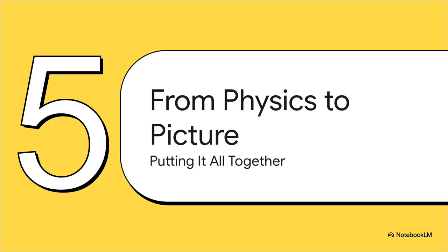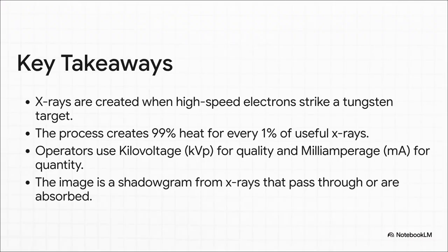So let's put all these pieces of the puzzle together. When you get right down to it, a dental X-ray is just a shadow map, created by this beautiful little dance between all these different atomic level interactions. So let's recap the big stuff.